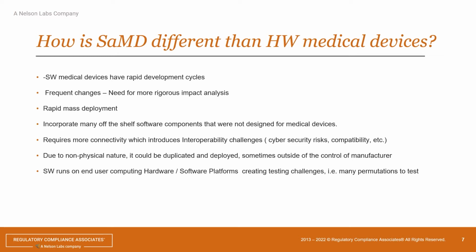Also, software as a medical device typically uses off-the-shelf or SOUP, software of unknown provenance in the IEC 62304 terminology, that helps you do the rest of the stuff, whether it's the operating system you use, your databases, your communication stack, or whatever else you need. You could just buy it off the shelf and incorporate it. But none of those things were designed for medical devices, so there are steps you have to take to make sure that, in terms of safety and efficacy, they do what you need them to do.